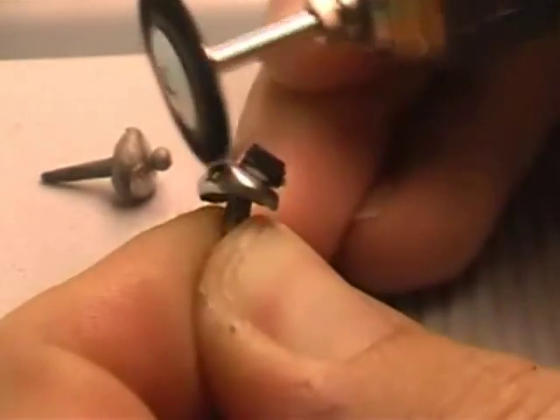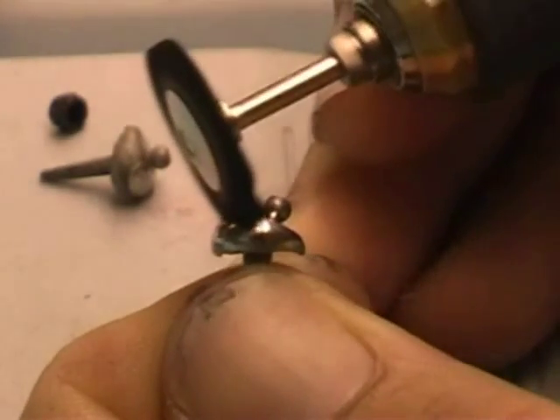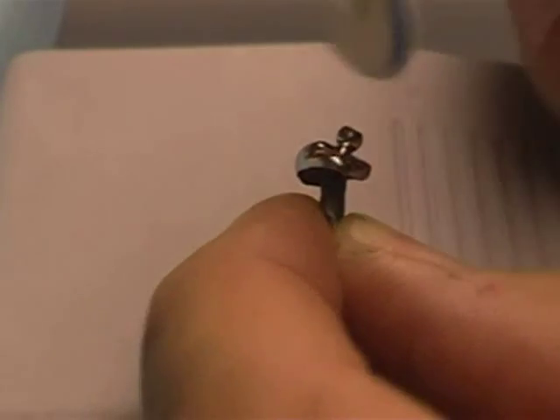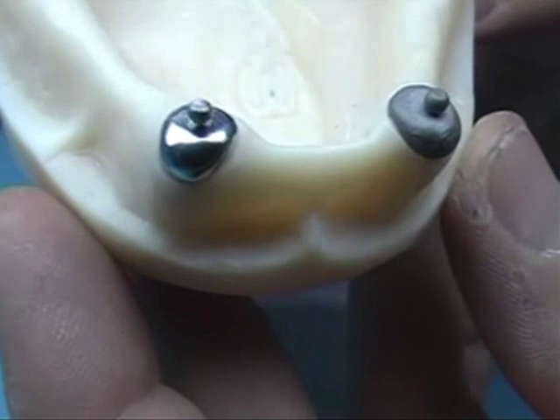Polish the cover well in order to avoid plaque receptacles. It's not necessary to polish the sphere. Just lightly touch it with cotton burrs in order to smooth it gently without wearing it out.